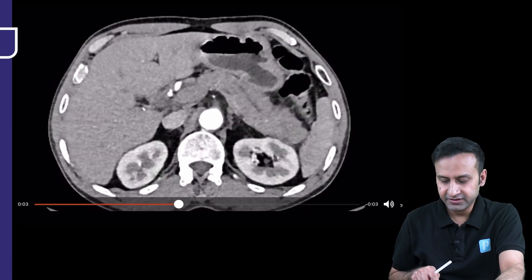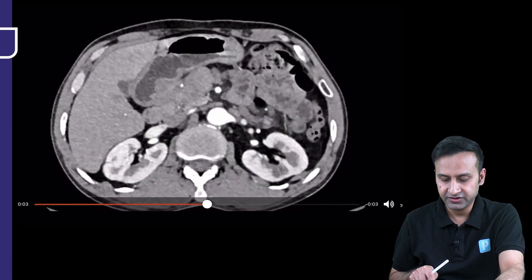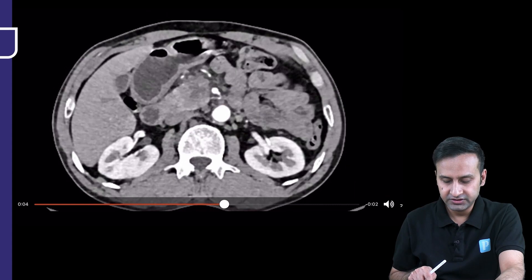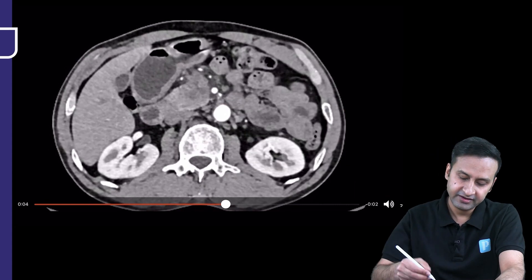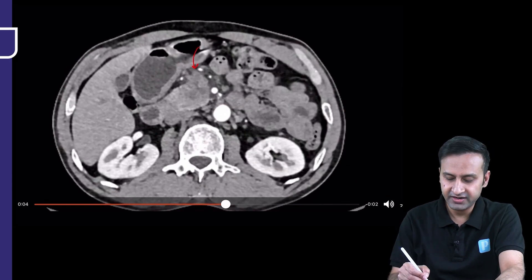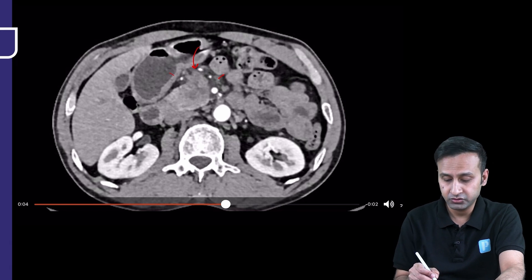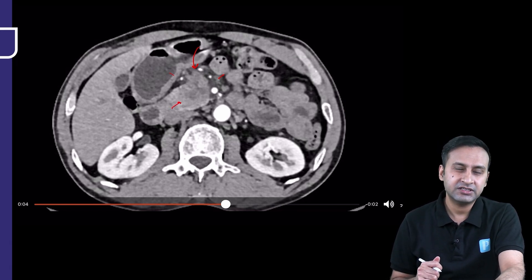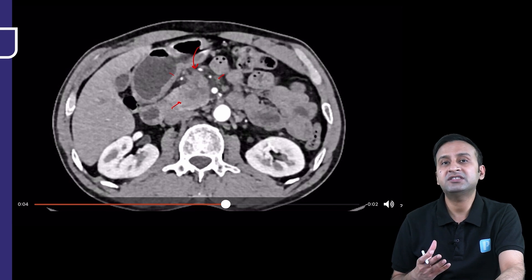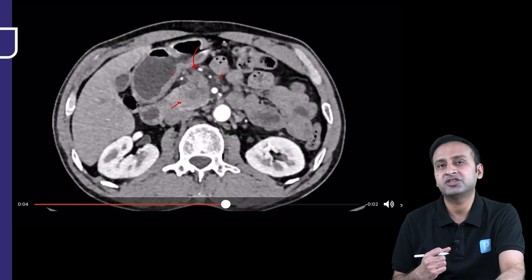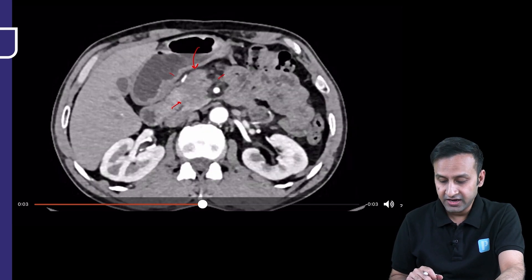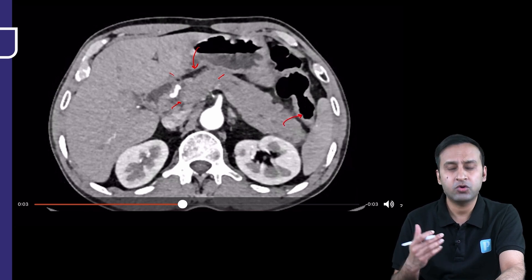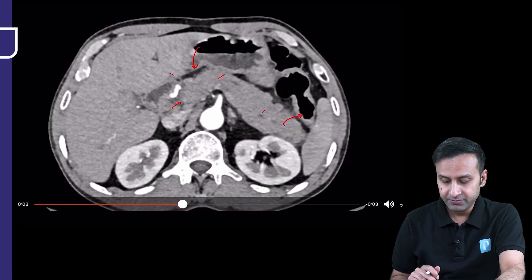I can definitely see the main pancreatic duct is slightly prominent — not significantly dilated — and the biliary radicals are okay. But going down in the region of the pancreatic head, I can not only see some stranding in the peripancreatic region, but also some irregular, ill-defined hypodensity within the pancreatic head. This area of the pancreatic head or the uncinate process is hypo-enhancing compared to the rest of the pancreatic parenchyma.